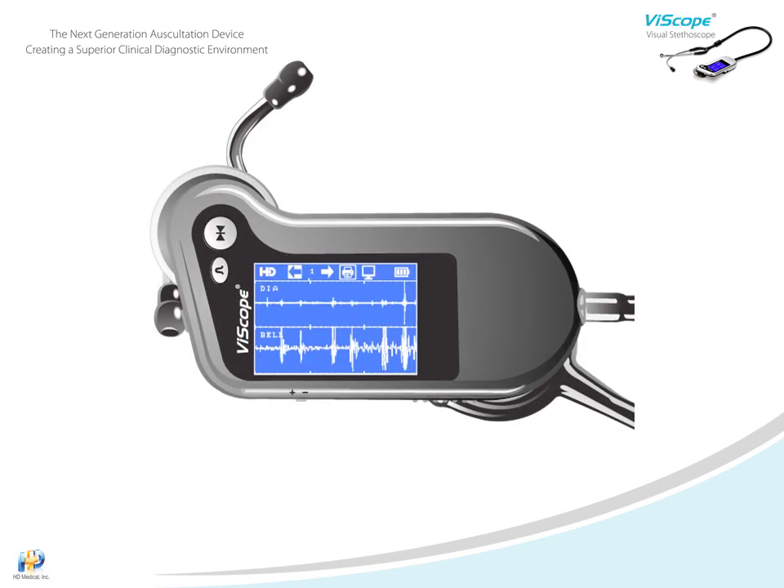Among the many visual advantages the Viascope offers is the ability to observe heart waveforms as a stationary trace. Heart waveforms are frozen on the display and made available for further review or discussion. This is done by simply holding down the freeze-unfreeze key and then releasing it when you have a clear waveform. When you are finished, press the key again and the Viascope is ready to continue with auscultation.